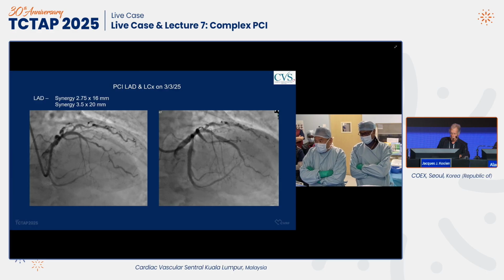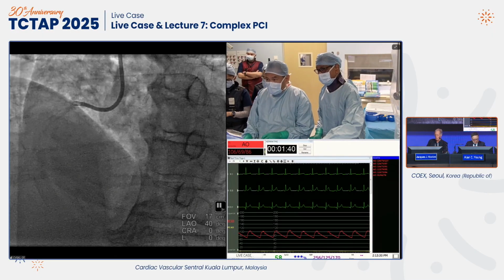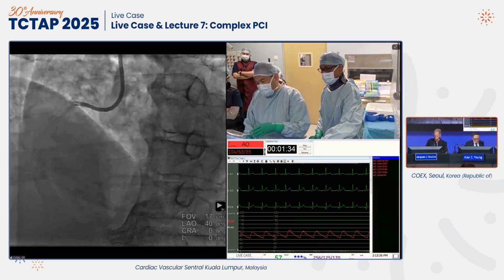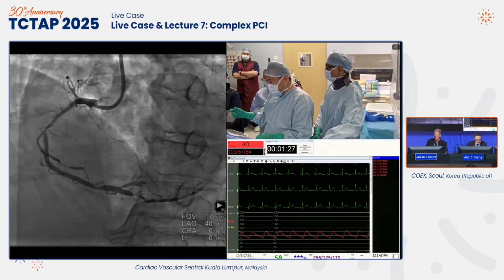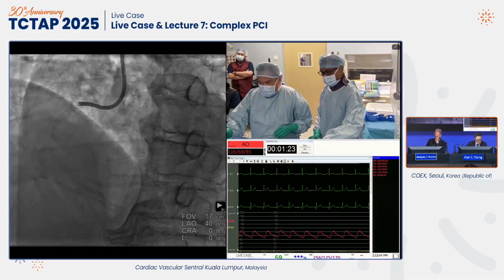So Rosli, maybe show us what you have done. All right, can we go to the imaging next, next slide please? We're asking as well whether you pre-dilate and looking at getting some detail. We will show you the live images later, but can you go to the next slide? Simon, we have got a cheaper alternative to you than a Shockwave IVL. We're going to use a mechanical IVL, and this is something new. We have had our hands on it last week.